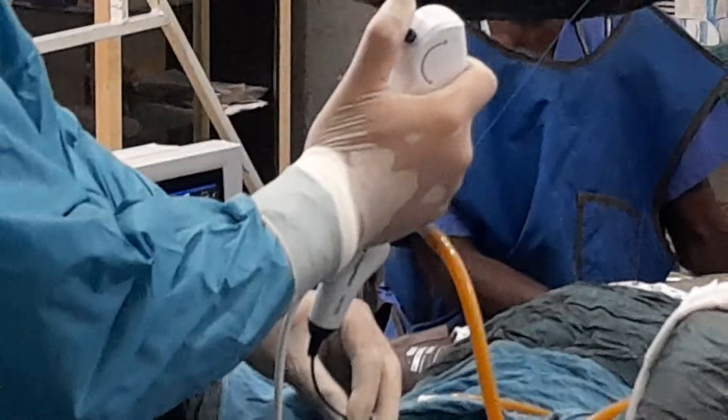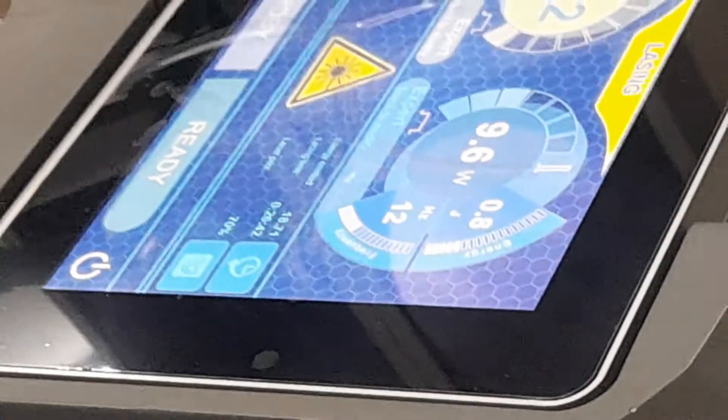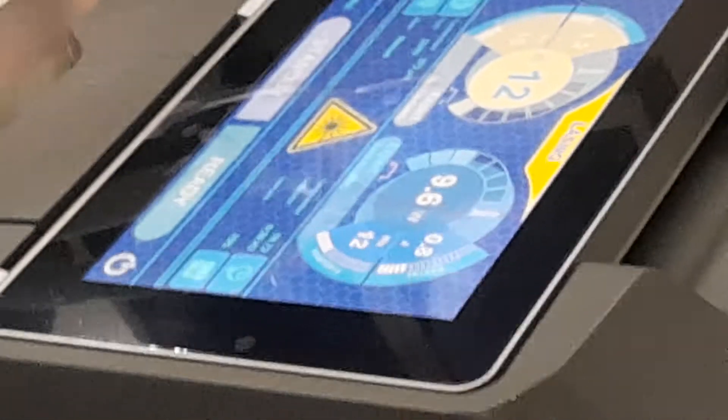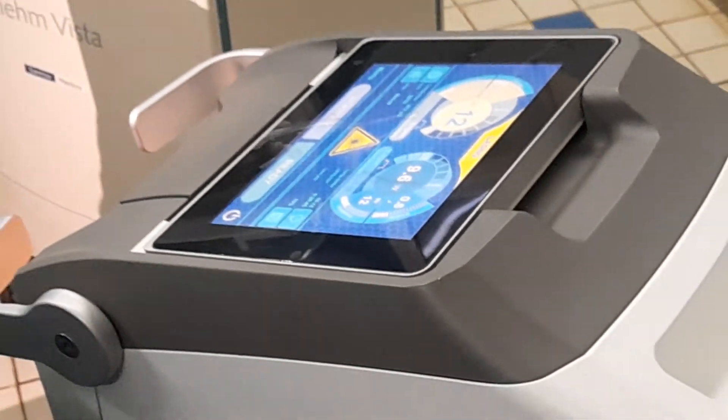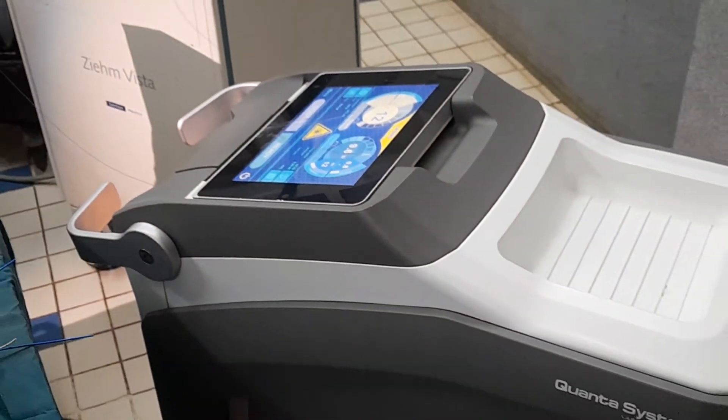And that is how you manipulate the endoscope. This is the fiber for the laser, and this is the laser machine, and this is the fiber that the device uses.